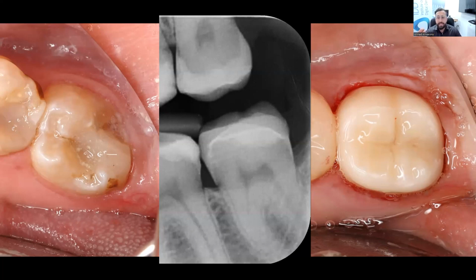A single Emax restoration block is around 25 USD, around about that, maybe less. And you can compare that to what you're getting charged for your lab fee. So in New Zealand dollars, an Emax restoration can be $200, $300, $400. And so really that's where the ROI comes in from purely a monetary point of view.